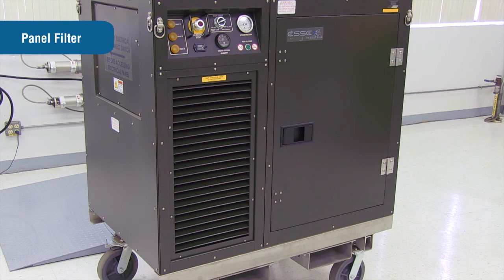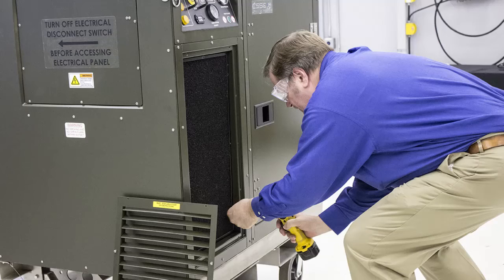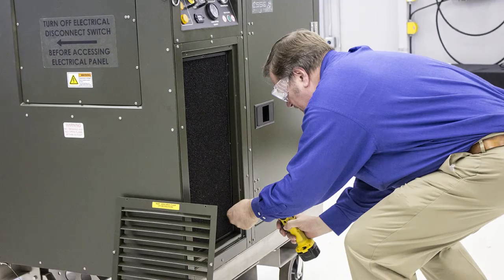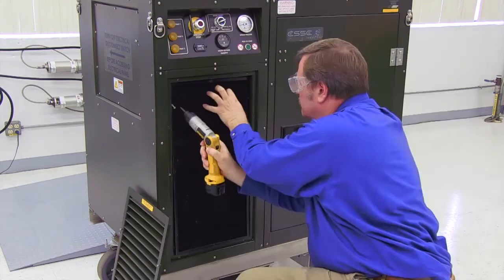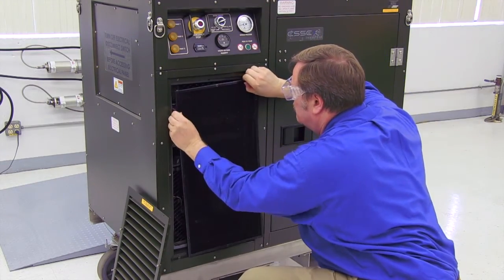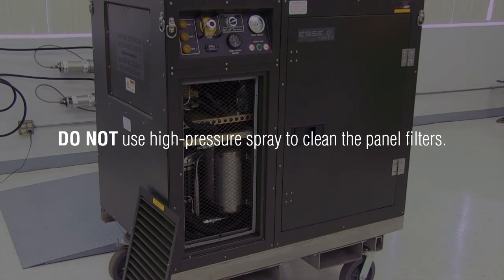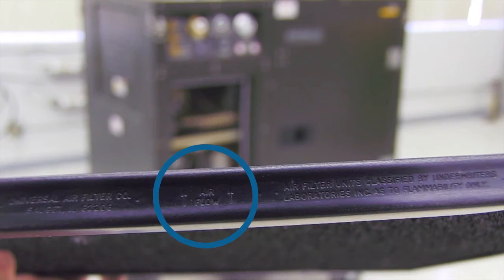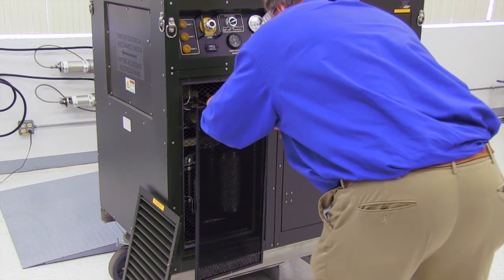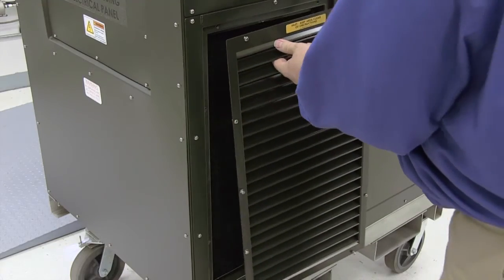The panel filters are located behind the louvered panels on the front, back, and right side of the OGL. To inspect, clean, and/or replace the panel filters, detach the louvered panel by taking out the Phillips screws that hold it in place. Remove the panel filter by taking out the Phillips screws that hold it in place. Clean as required with mild detergent and water. Do not use high-pressure spray to clean the panel filters. Dry completely before reassembling. Arrows are located on the side of the filter frame indicating flow direction; the filter should be installed so flow is front to rear of the OGL. The panel filters should be checked monthly, more frequently if used in extreme environments.